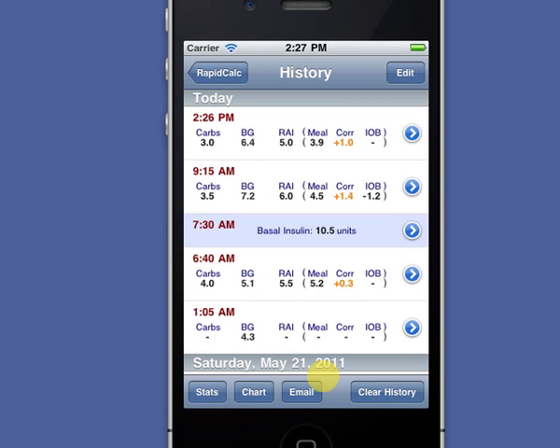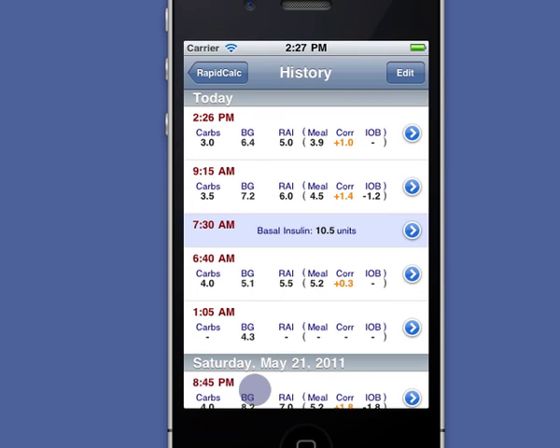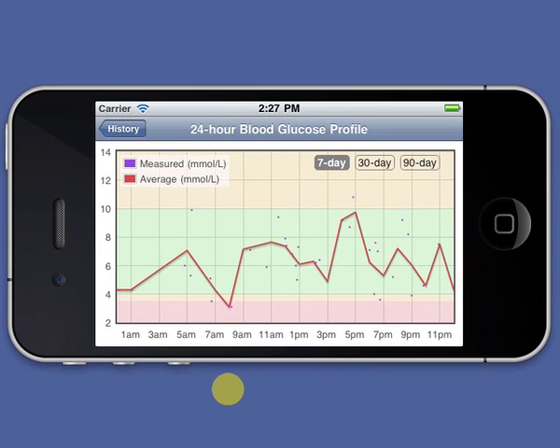I can even see my blood glucose levels profiled over 24 hours a day for the last 7, 30, or 90 days, so I can easily spot any patterns in my highs and lows.